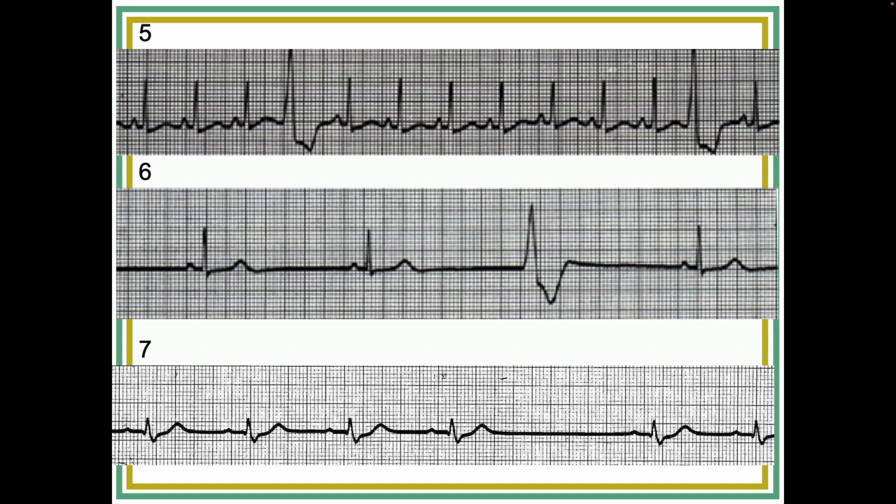Do you think, well, I guess this probably goes into what a ventricular beat is, and I'm not trying to do that, but do you think later on down the road, this ventricular beat may not necessarily be overwhelming the standard QRS, so it would be kind of off, it wouldn't be on time? Oh, I see, if it happens again, yes. Okay. Yeah, I mean, possible.